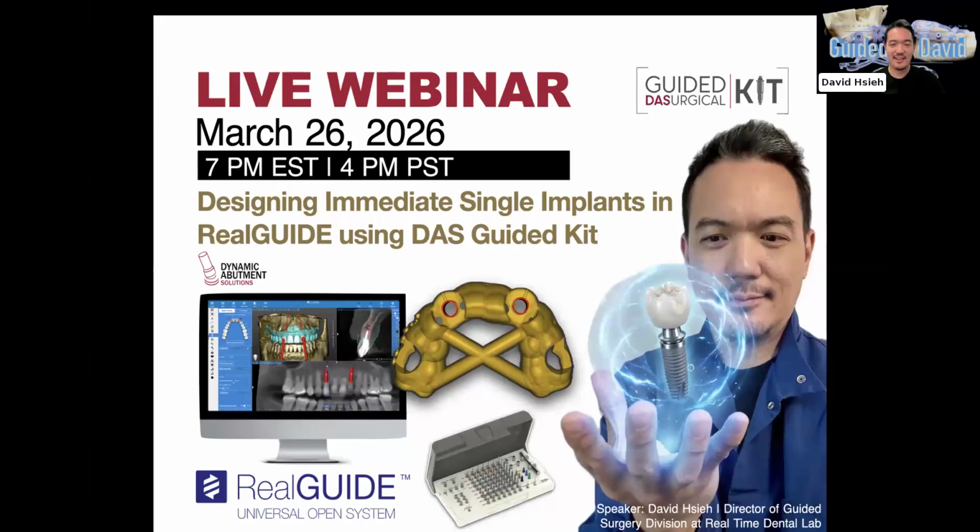So welcome everybody. Tonight we're going to share the surgical guide fund together, because I got some feedback that in the past couple of webinars I went too far, too difficult. People reached out to me saying, hey David, can you make something simple and straightforward, from A to Z, and the reason why and how? And here we are today.